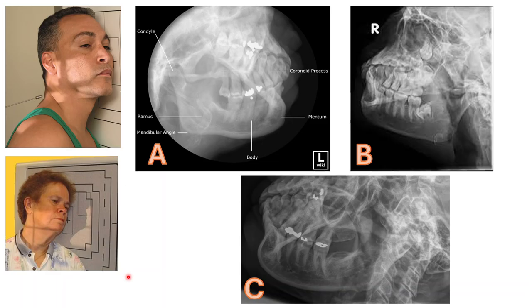As far as the boards and our radiography textbooks are concerned, they are going to focus on the lateral position with the IPL being perpendicular to the IR and a full 25-degree cephalad angle on the tube. I just like to show my students this positioning because clinically a lot of the time we will adapt to the patient and the condition and change our positioning to a slight tilt on the head and less angle on the tube. Now, let's look at the images and discuss some radiographic criteria.